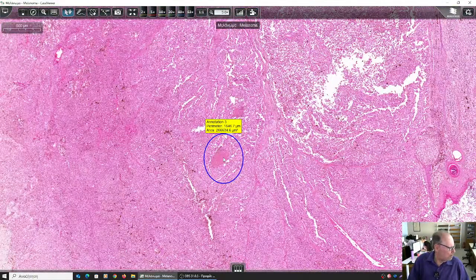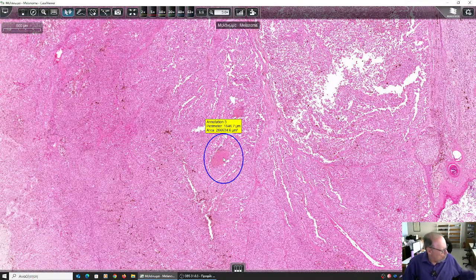What type of necrosis is this? This is coagulative necrosis because it results from ischemia. The malignant melanocytes have such increased potential to grow that neovascularization is not enough, so they become necrotic.